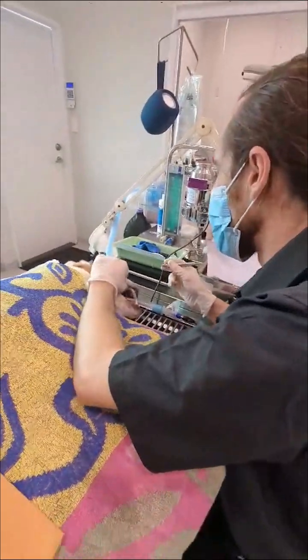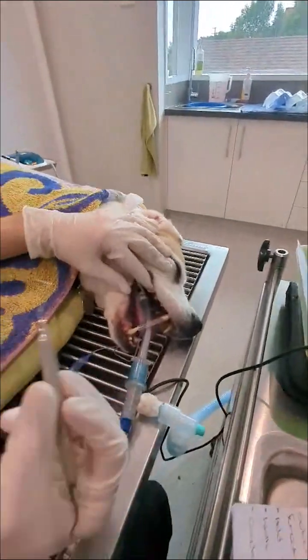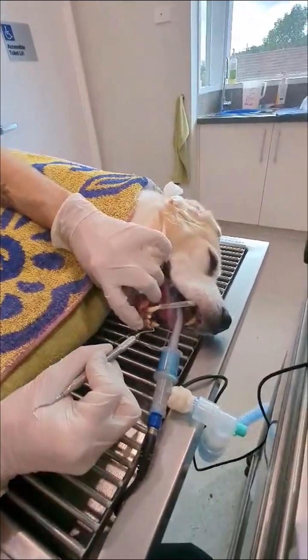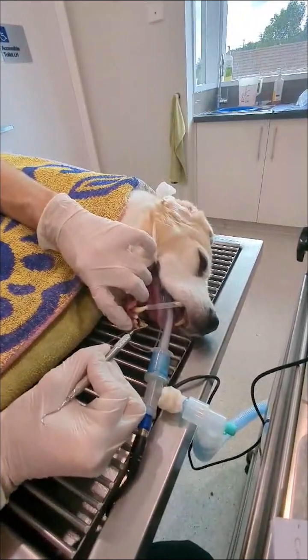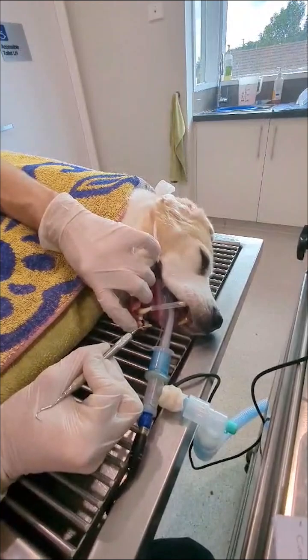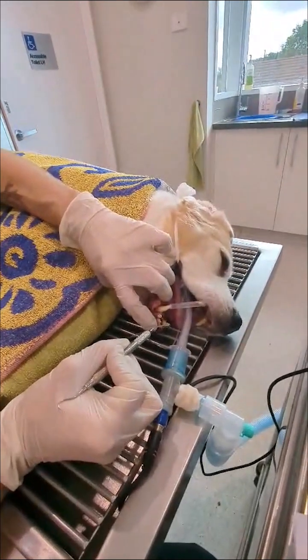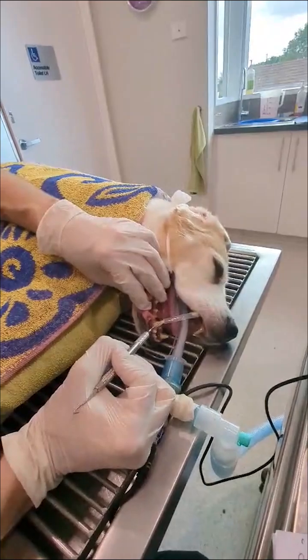We will begin by probing every single tooth around the particular area. So you want to hold it in a modified pen grip. You want to be very careful when holding it. So I'll just note here, we'll be going from the 403 incisor. So we want to be probing around the entire circumference of the tooth. We want to be taking note of the mobility. We want to be taking note of the gingival sulcus, the pocket depth. If we've got a pocket depth of anything above 2 mils, it does require investigation, and we'll note that on the dental chart.